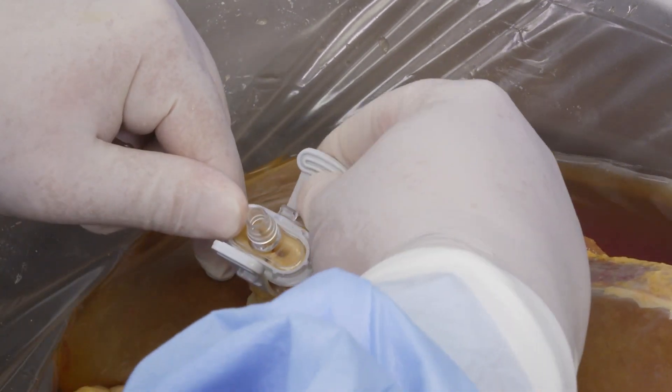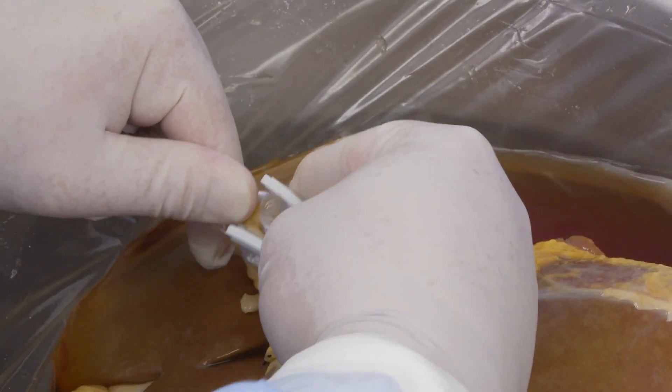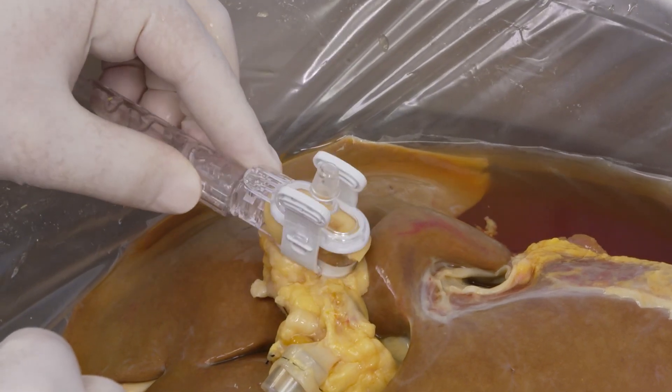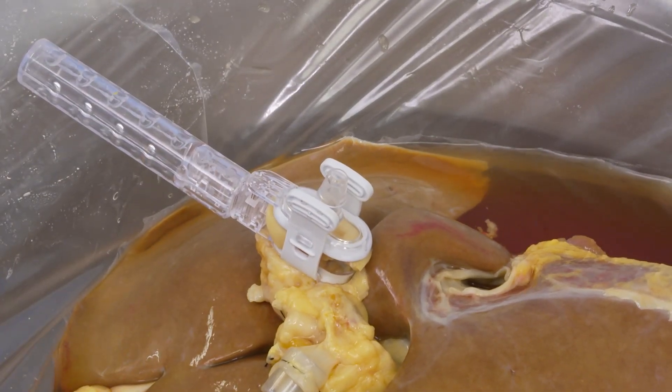Apply slight pressure and close the seal ring cannula. Pull each strap upward and secure it to the post on the upper half. The handle of the cannula can be removed and discarded if desired.